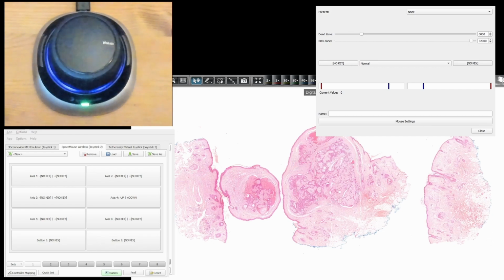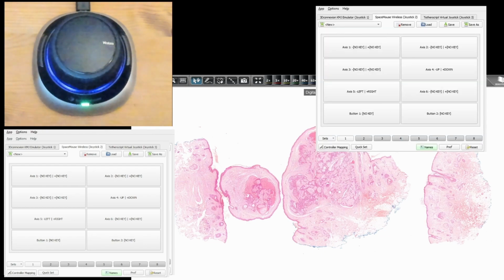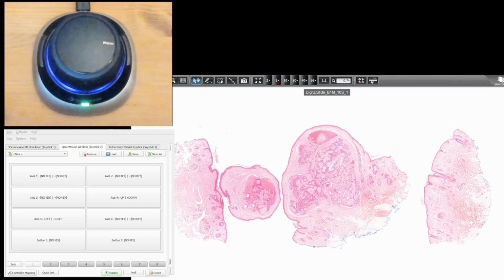That's all we have to do. Again, it's a relatively easy process. You will see the buttons need to be pushed and they will be automatically assigned. To the left you do the left key, and to the right you go to the right button, and you have got this sorted out.